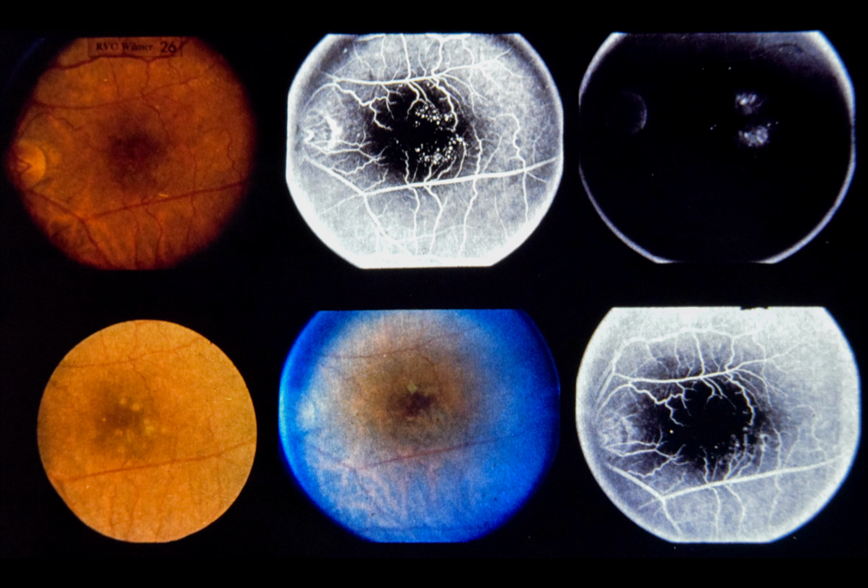Because visual acuity was reduced by macular edema and because leaking capillaries were clearly identifiable on the fluorescein angiogram, this patient was treated with argon laser photocoagulation. Each leaking microaneurysm was coagulated using the 50-micron beam diameter at sufficient power to produce moderate whitening.